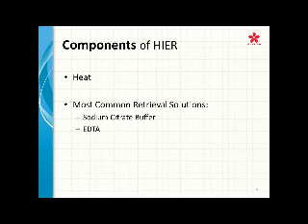Within heat-induced epitope retrieval, a lot of these solutions are commercially made. If you're doing immunohistochemistry automated, your antigen retrieval solution is something that you're purchasing. Generally, people don't make it by hand too much anymore. But to give you an idea of how this reaction works automated, just think about if you were doing it non-automated.